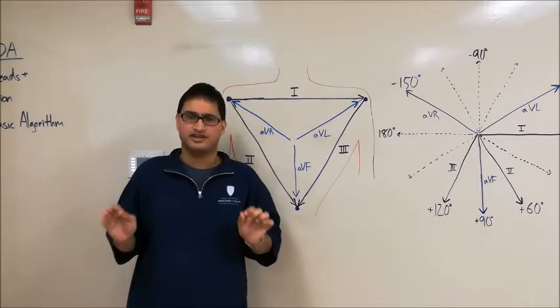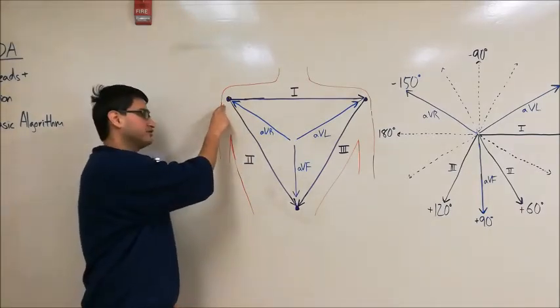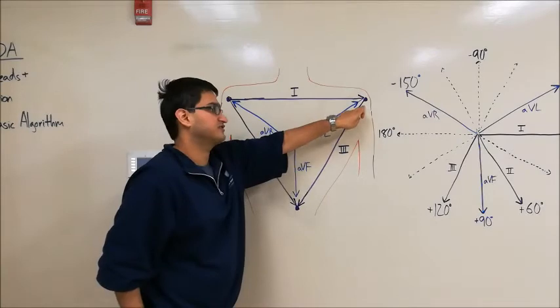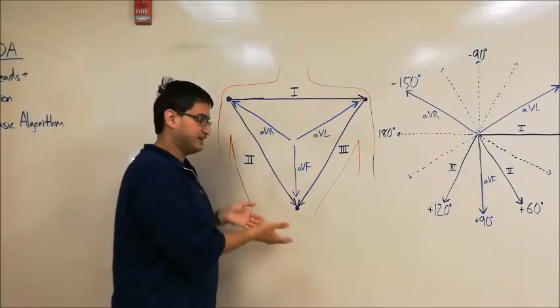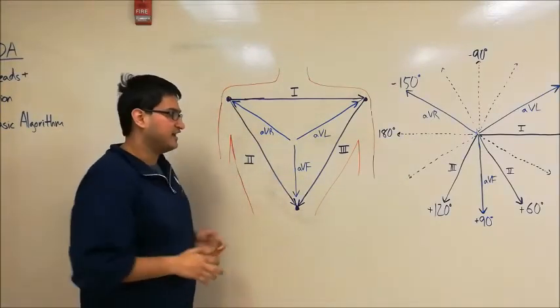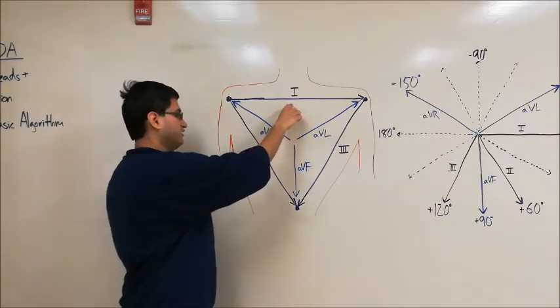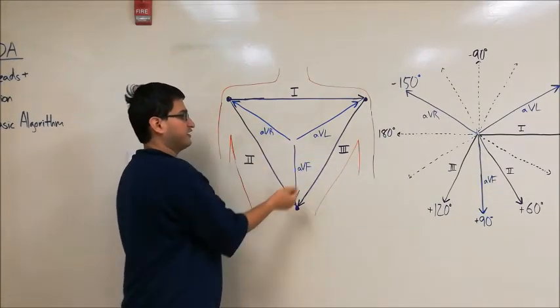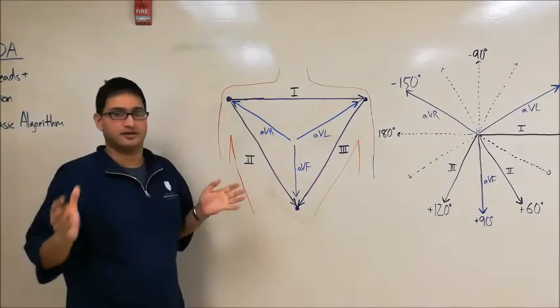These 3 electrodes are drawn here as purple dots. We have one electrode drawn on the patient's right shoulder, another electrode drawn on the patient's left shoulder, and there's another electrode that's placed on the patient's left foot, where we've drawn it here just as their inferior because it's going straight down. Now, the 6 leads in this hexaxial system are lead 1, 2, 3, and leads AVR, AVL, and AVF. I'm going to start talking about each one of them.